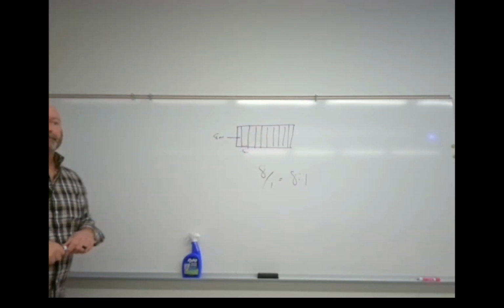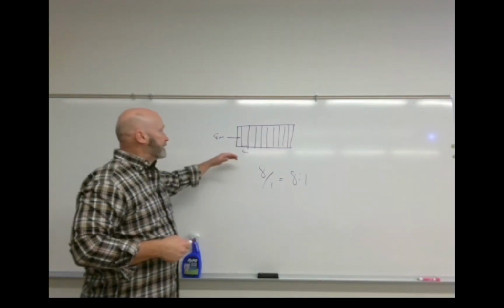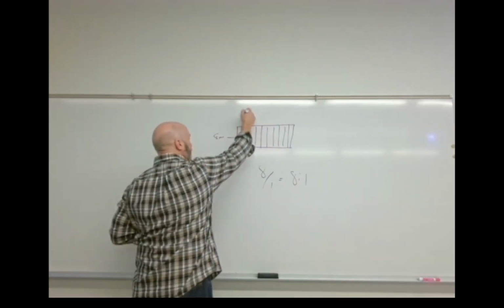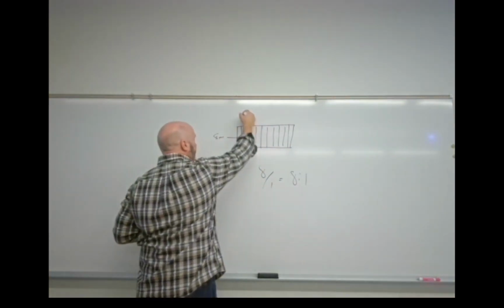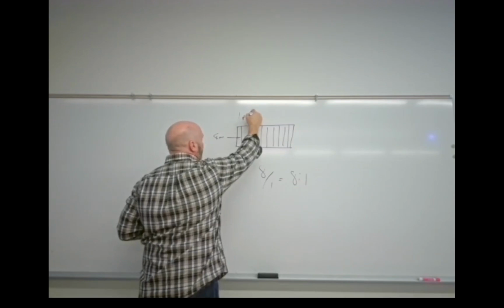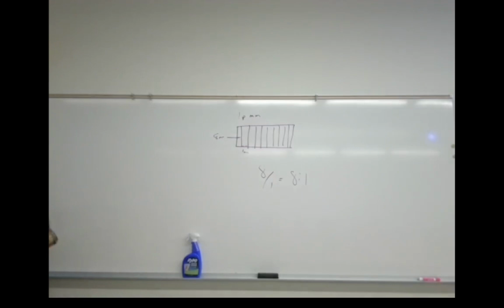Okay, so in this case, what we might have is a frequency of one grid strip every, I don't know, 1 per millimeter.